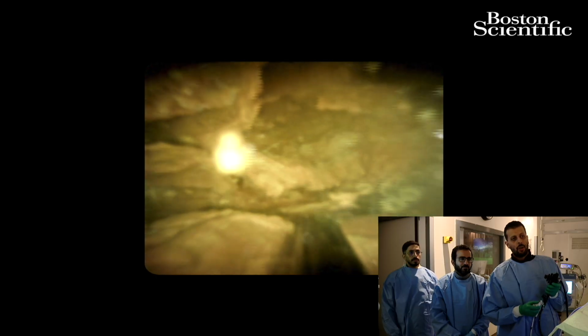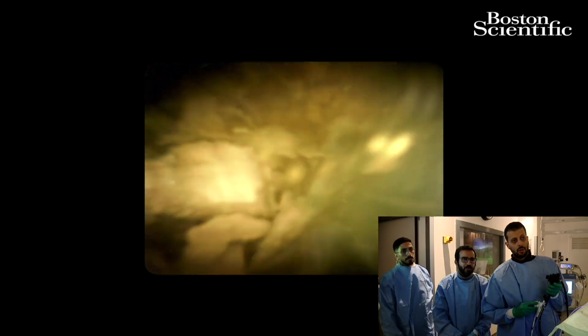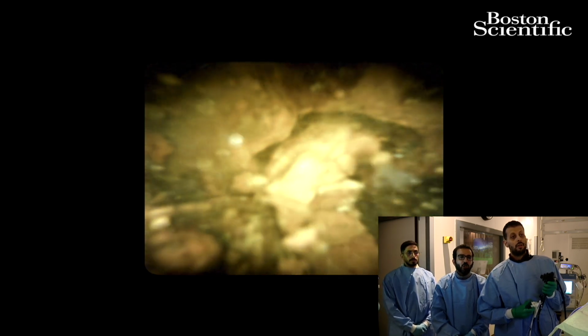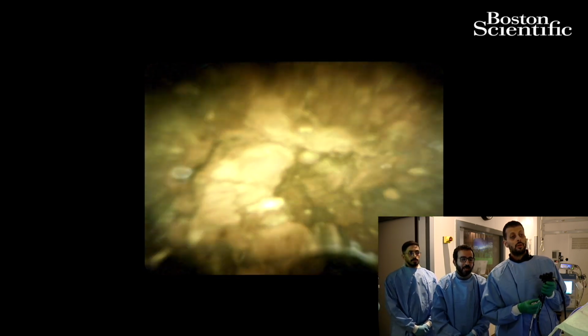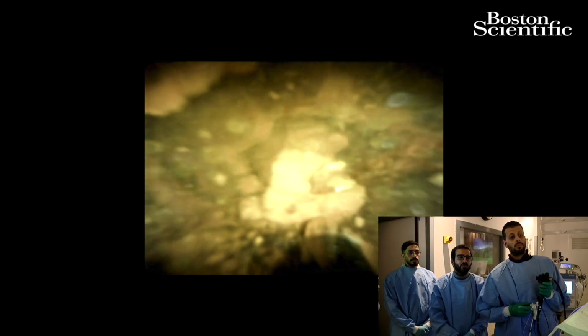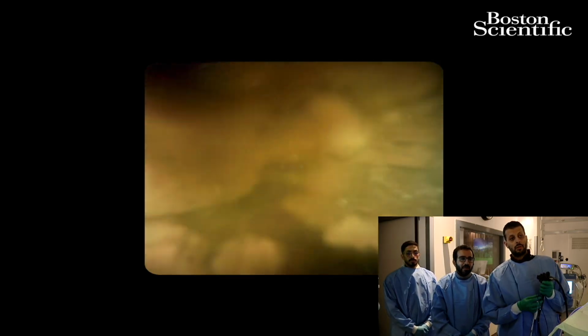We usually put it on medium on our system, and we can always go higher or lower if needed. We'll probably never go lower, but we usually need to go higher. So we can start off low or medium and then go to high power if needed. If we put low or medium, then we increase the pulses. But now we are in medium, so we put the pulse at the maximum of 30.